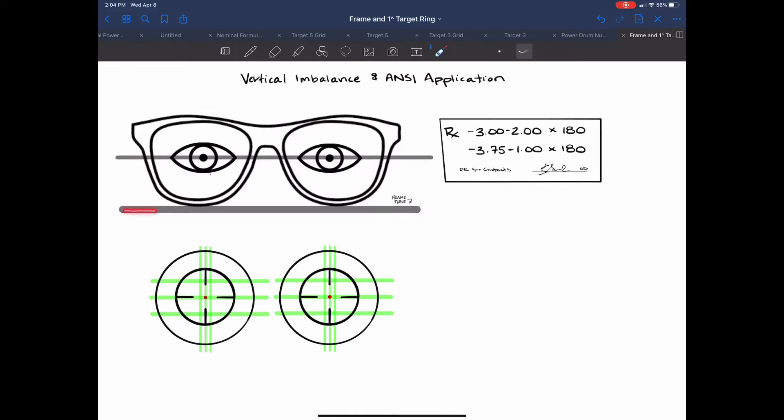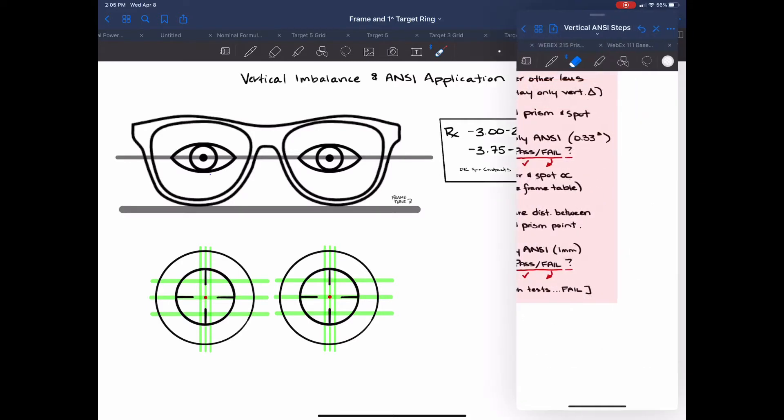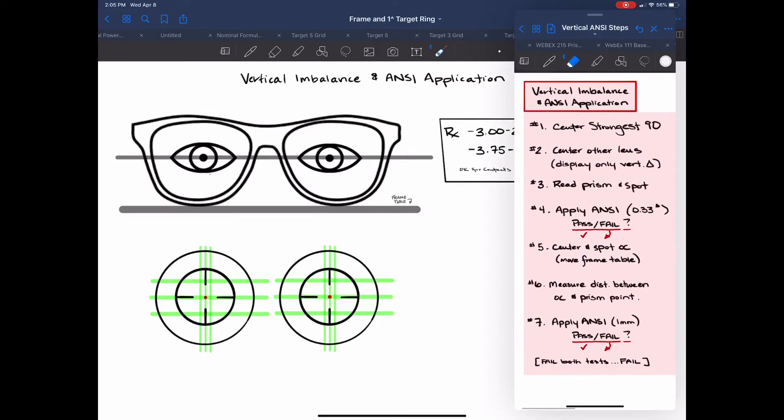One of the stipulations is that once we line up the one lens and then we go to center the other one we cannot move the frame table and that's how we're going to be able to know that we have vertical imbalance amount. So first things first let's reference our instruction list.